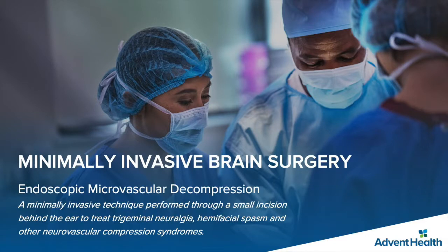Endoscopic microvascular decompression is a minimally invasive technique done through a small incision behind the ear to treat conditions like trigeminal neuralgia, hemifacial spasm, and other forms of neurovascular compression syndromes.